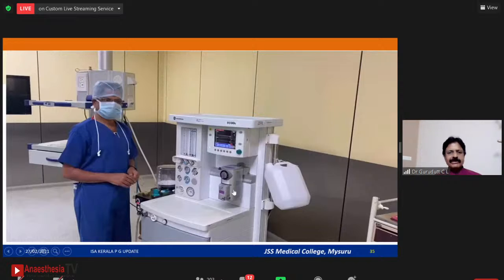So here in this video, I'll be demonstrating how you can differentiate whether the particular system has got the Link 25 or the proportionating device like ORMC or SORC. This is very important for your exam, because in the exam center you may have a Draeger machine or the GE machine. I told you, in the GE machine you have the Link 25, and in the Draeger machine we have the ORMC or SORC. How to know which one is there?